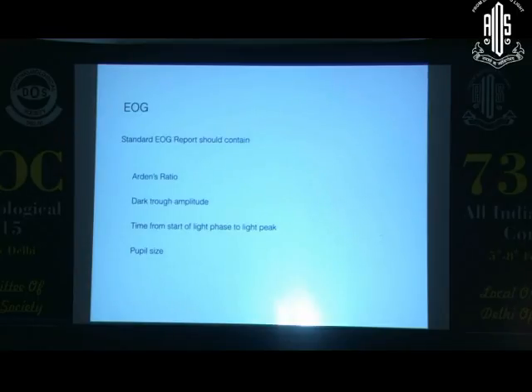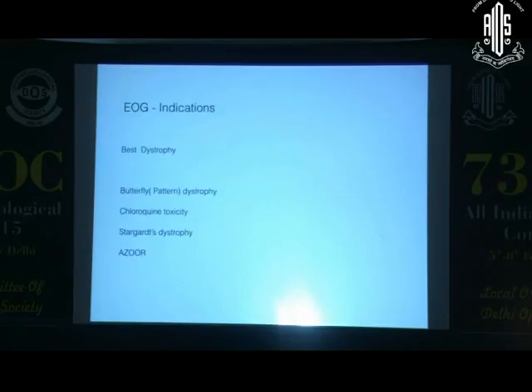This is what your standard EOG report will contain. One of the only clinical indications is Best dystrophy. We generally don't, it's quite a cumbersome test. So it's not a great idea to routinely order it in all cases. It doesn't give you much added information in the present day.